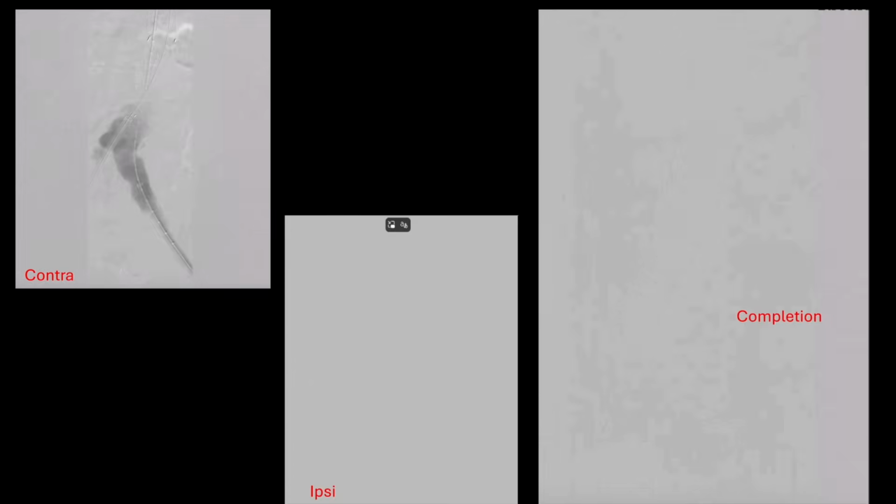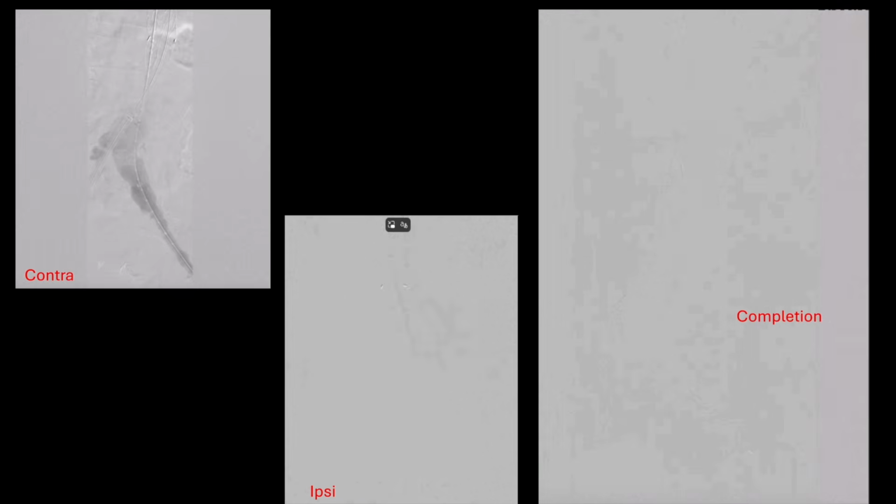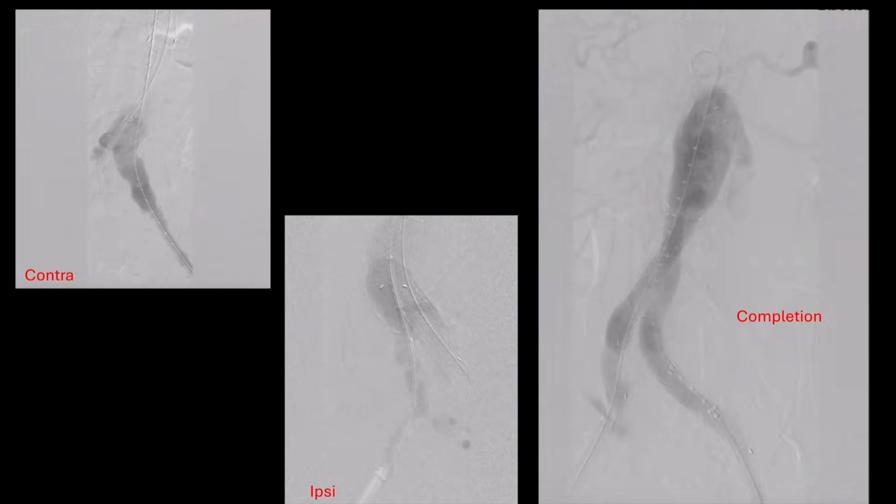You can tell we're in a near lateral position as we are planning to land our device just distal to the single mesenteric vessel. We selectively catheterize the mesenteric vessel and leave our catheter there so that after we partially deploy, we have safety access to that vessel. And after that, we catheterize our contralateral gate and extend, then extend our ipsilateral limb, and on completion aortogram, what do you see there? Well, you see that we still have a type 1A endoleak filling our aneurysm sac, so we do not currently have any seal.